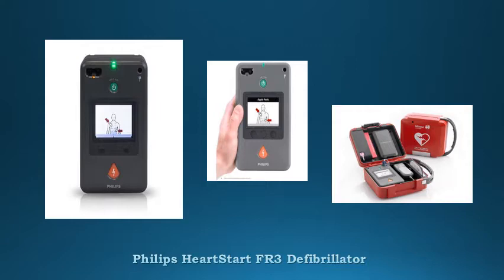Package includes a 5-year warranty, Smart 3-pads one set, primary battery, user documentation, and free Philips HardStart HeartReview Express software.